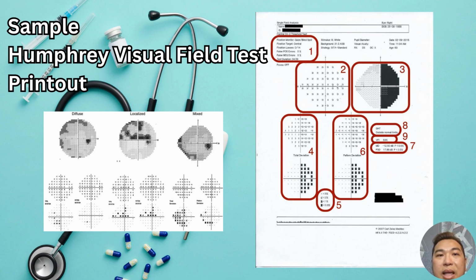Reliability index and test parameters: fixation loss, false positive, false negative, and test duration. By interpreting these sections together, clinicians can identify visual field defects, assess reliability, and track changes over time for accurate diagnosis and monitoring.